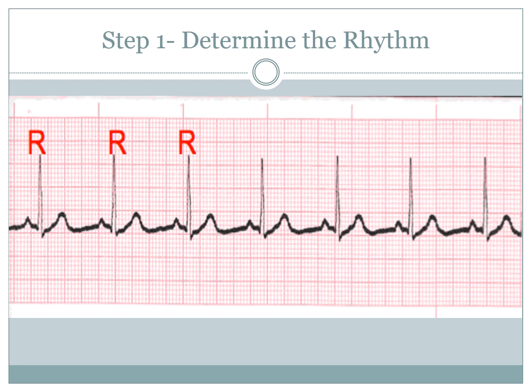So the way to test for regularity is essentially you can look at the P's, that's testing the regularity of the atrium, and then you can look at the QRS. Okay? Check the regularity of the QRS. So if you have the same distance between every QRS complex, then it's regular.